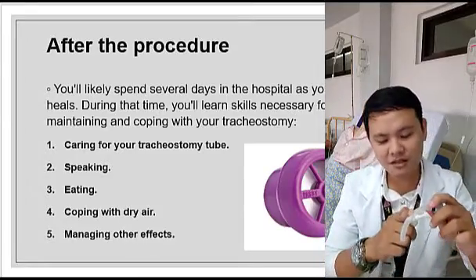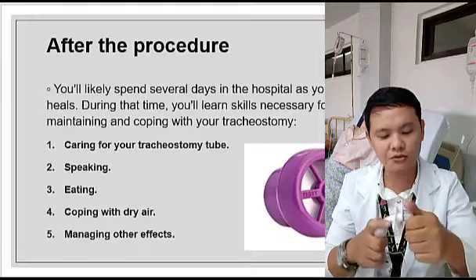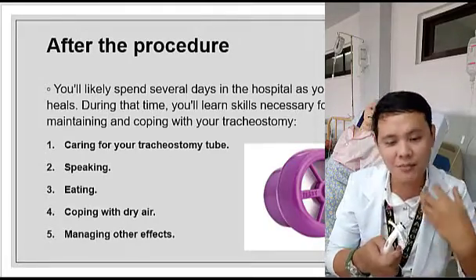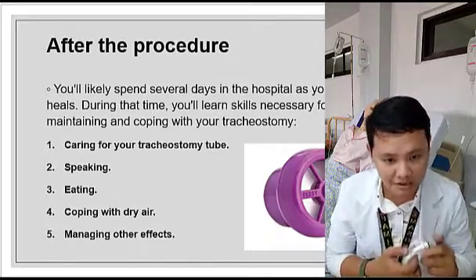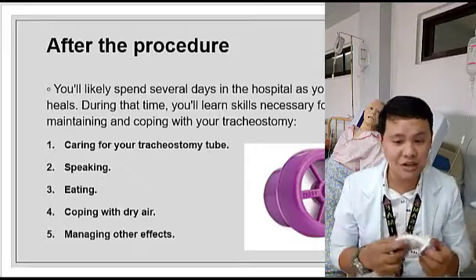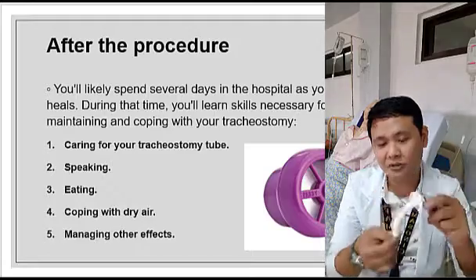Noong this one, the one with the hole, the fenestrated. And then of course, lock dapat ito. Nasa ganun, dito na yung air lalabas. Okay, mas makakapagsalita ka. Although, hindi ganun kadali ang magsalita. That's why you need a speech therapist or a nurse that specializes when it comes to the tracheostomy. Okay, hindi po ganun kadali ang magsalita kapag ka merong tracheostomy.